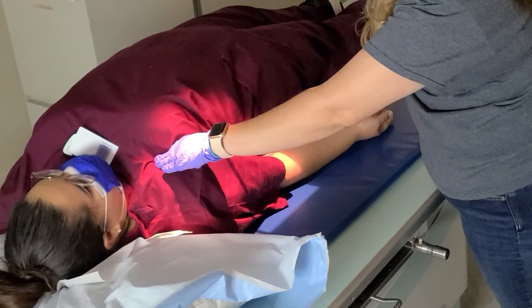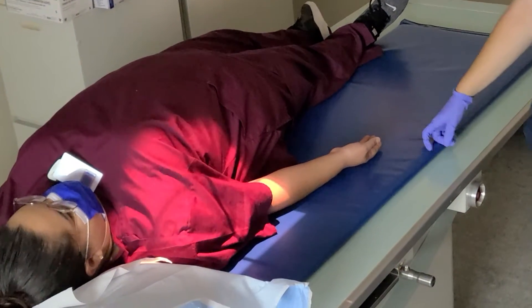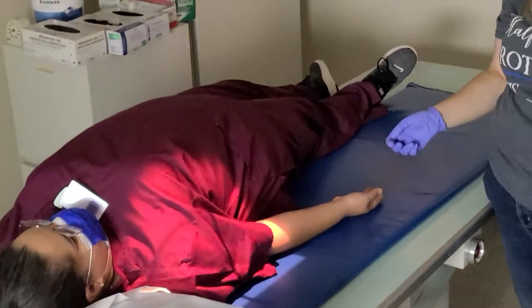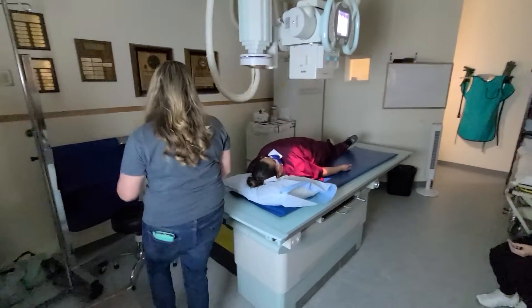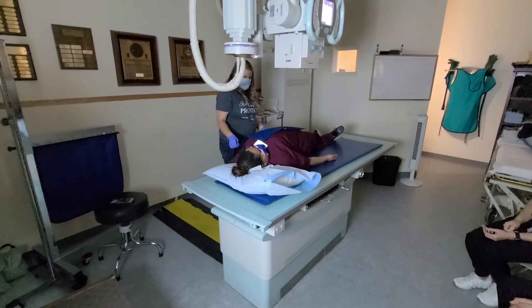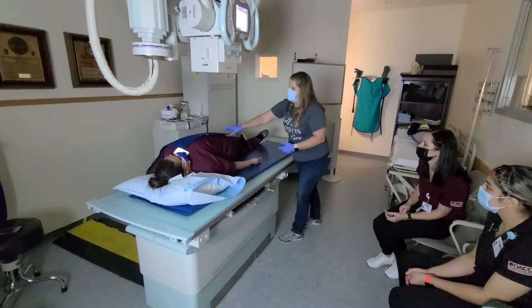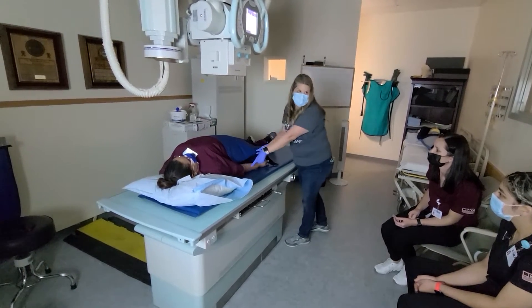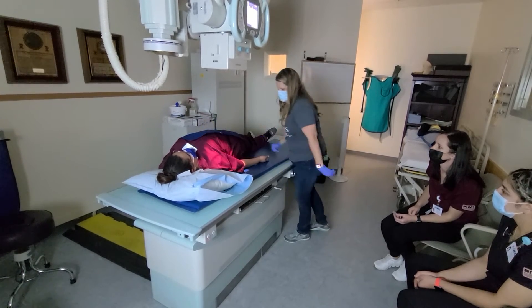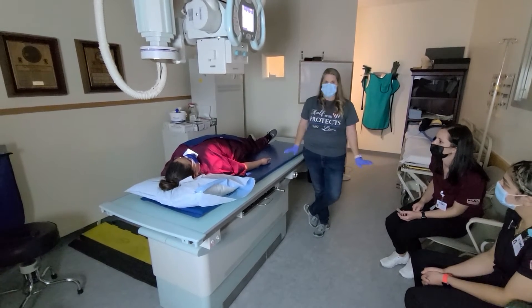Just be cautious that you don't cut off the head of the humerus, because the head comes way in toward the body. Then place your right marker there for this one. The technique is 64 KVP at 8 mAs. For males, you can shield across their lap. For females, you can shield the breast tissue, because breast cancer is a risk. When laying it that way, make sure the shield doesn't go over the humerus and isn't casting a shadow up there. Everything's lined up — don't move, don't breathe, and click.